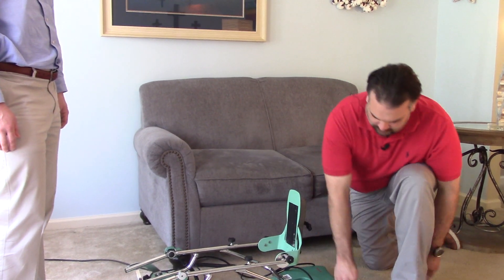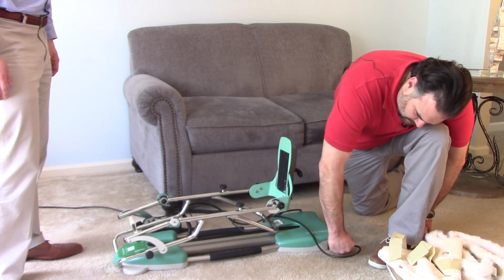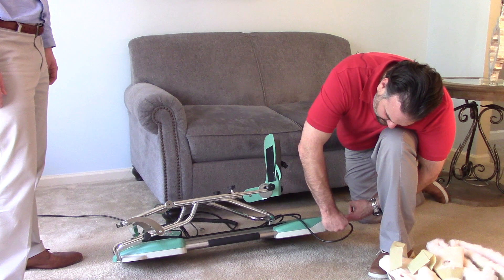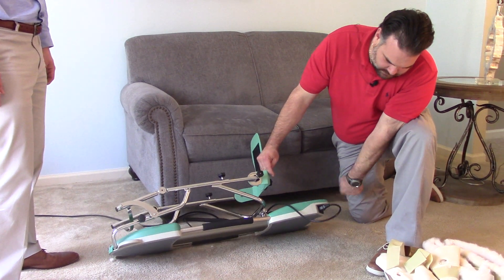First things first, you want to plug the machine in. You have a power cord, it's just going to plug right here. Sometimes it's a little tricky to get it, but it just pushes in. And then also down here is actually the power switch.